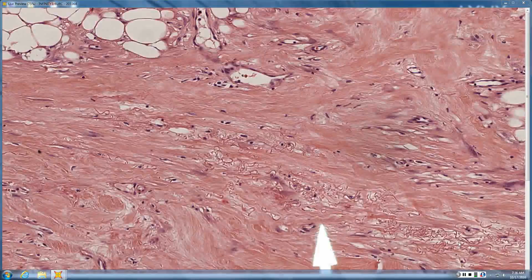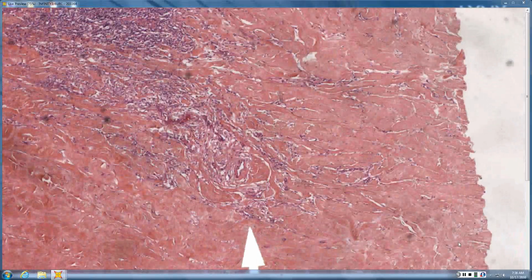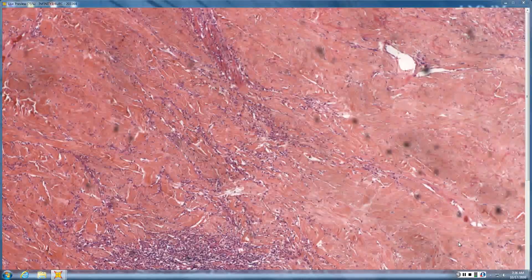and what looks sort of like solar elastosis, but it's everywhere, deep into the dermis, even down into the fascia. And we have some, not as prominent as they might be, but some fibroblasts. They're a little gray, large, stellate, perhaps. Hard, I think, just because we're seeing the edge of it. And you don't have as much edema here as you sometimes do, but chronic radiation changes.